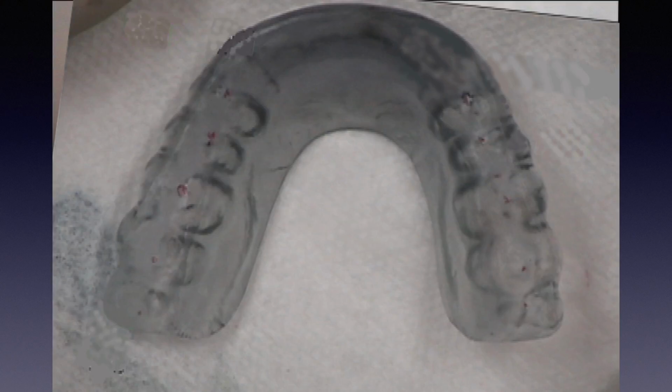The following is a demonstration on how to use the vertical holding fulcrum to adjust an orthotic. The patient has worn this for many years at night only and has remained perfectly comfortable. The occlusion on the orthotic was last adjusted a little over a year ago. It was made from flask-processed biocryl acrylic, which is reasonably hard, but over time attrition of the surface does occur.